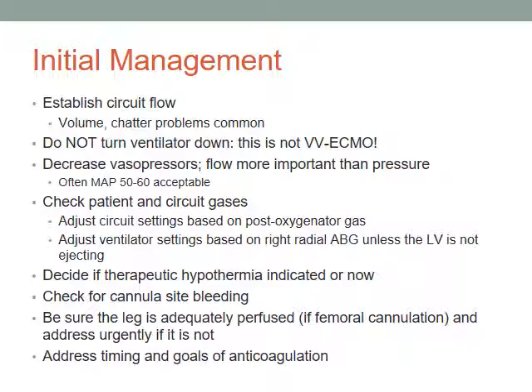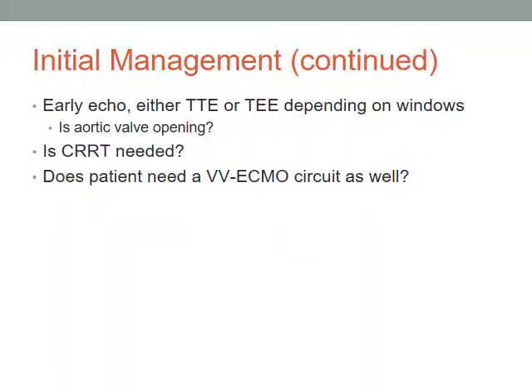Address timing and goals of anticoagulation. Very challenging. Initial management, early echo, either TTE or transesophageal. The important question is the aortic valve opening. Now you may be able to tell this from just a monitor. If your patient has no balloon pump and you have pulsatility, your heart's beating. If you have a balloon pump, it's easy to think your heart's beating as you see a spike. Turn off the balloon for a little bit. If it goes flatline, the heart's not ejecting.